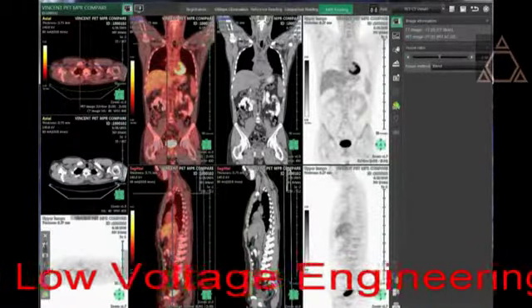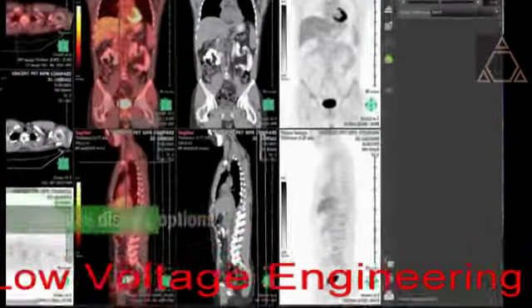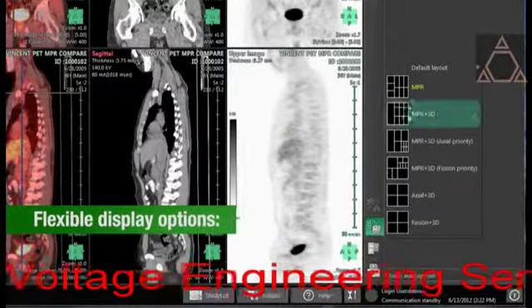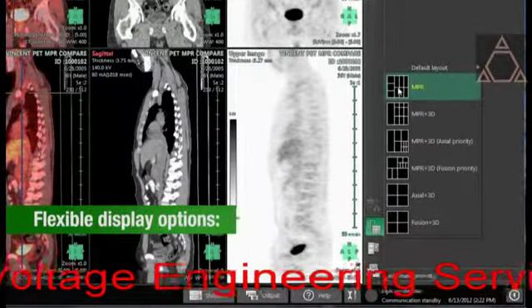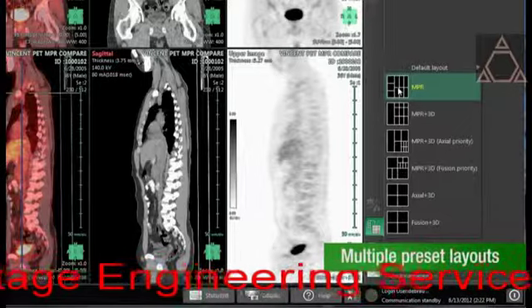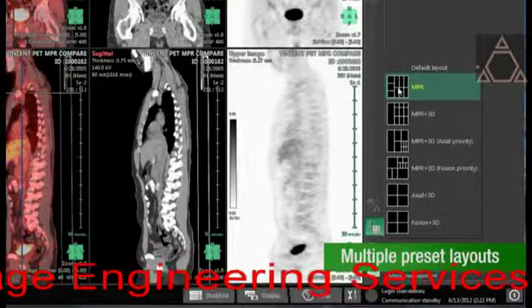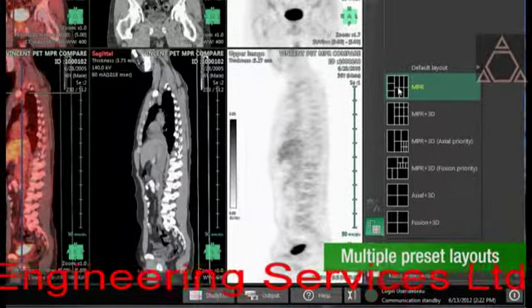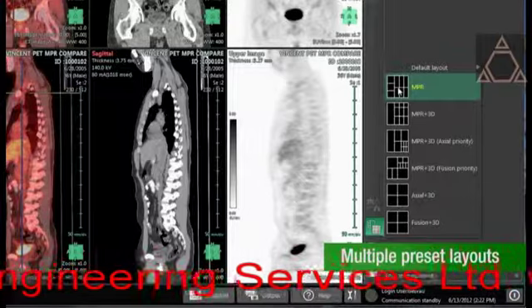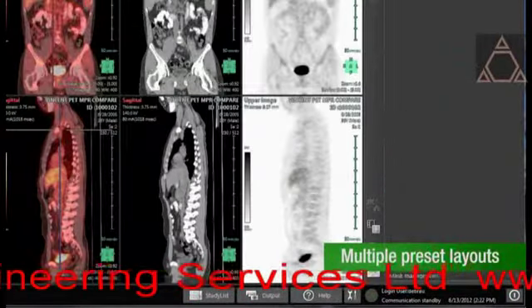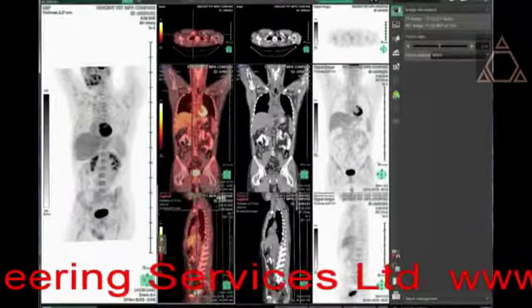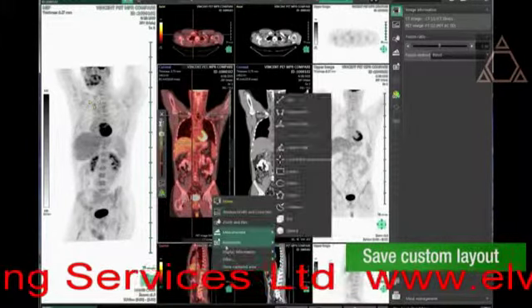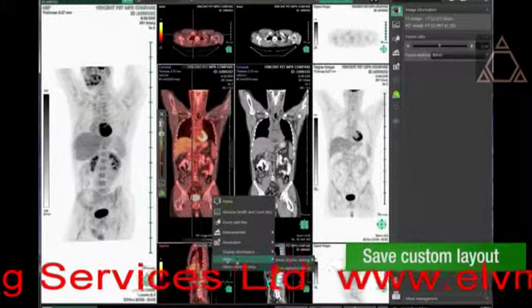Synapse 3D offers flexible display options that are easily accessible through the display toolbar. They include presets for oblique registrations, reference reading, comparison reading, MPR, and automatic CINE functions. Or easily customize a layout — simply right-click to register your preference.